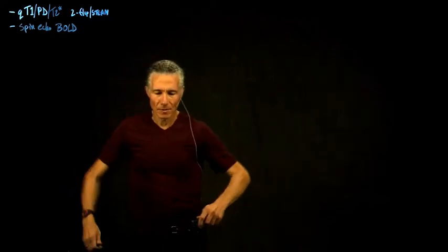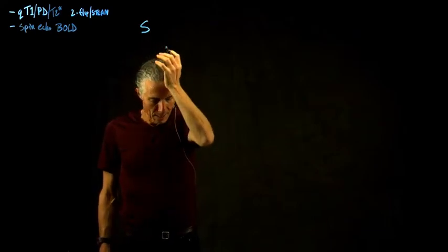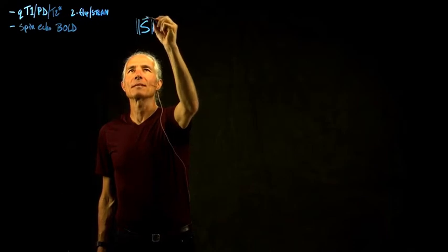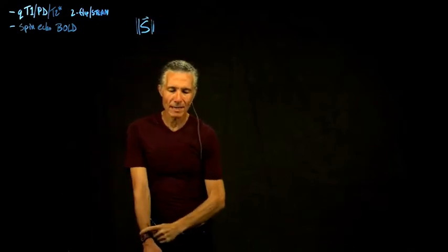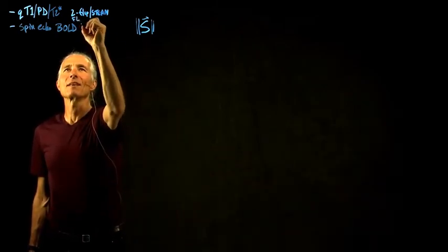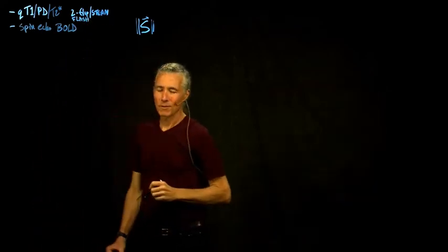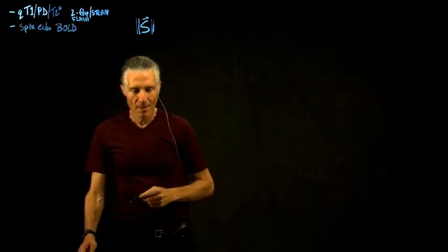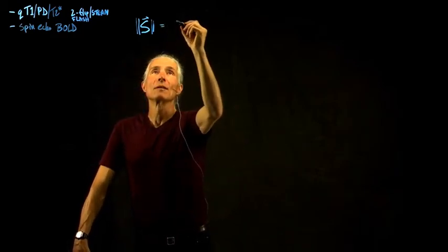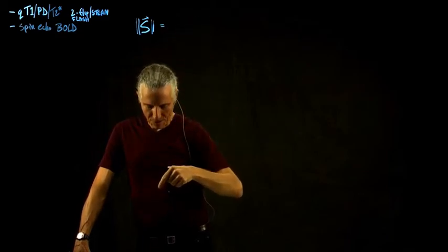So when we look at the signal equation, basically the amplitude of our complex signal for a gradient echo, so this is a two flip FLASH plus STEAM method. If we look at the equation for FLASH, it's basically equal to the proton density, which I call A in the notes.